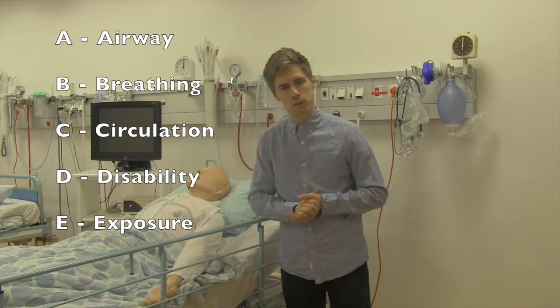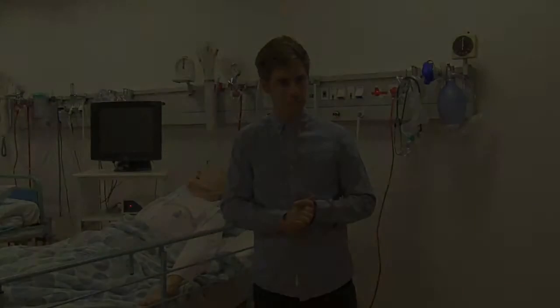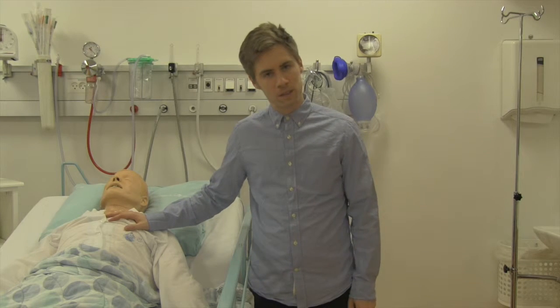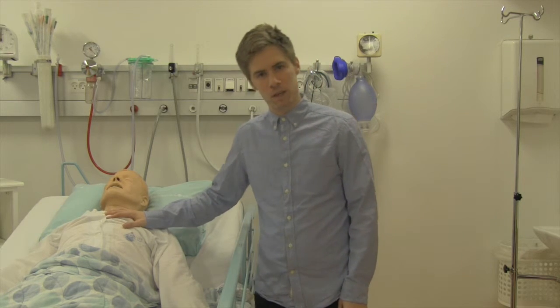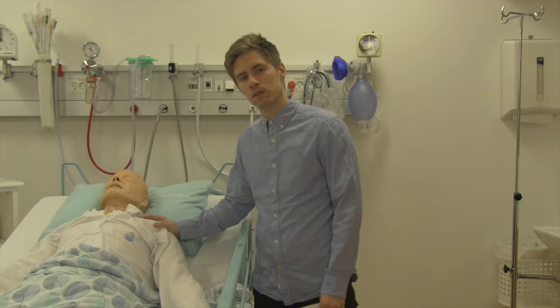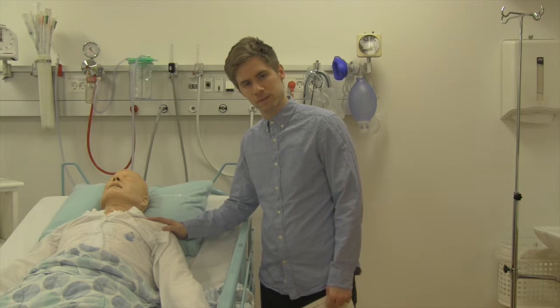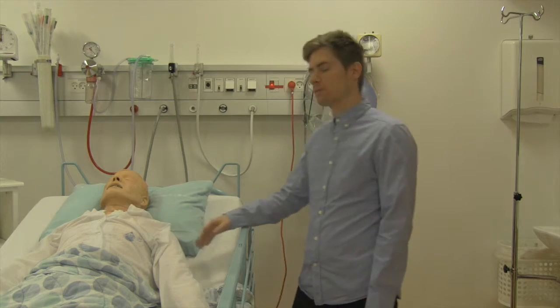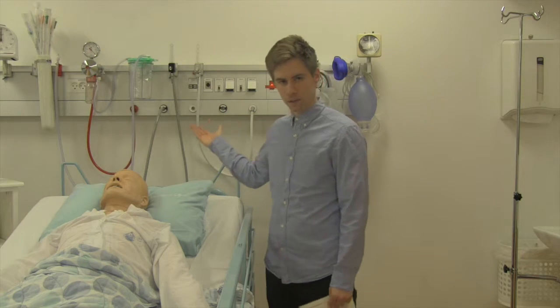Here at CAMES, we use the ABCDE approach. When introducing a mannequin, we start by introducing A, or the airways. We tell the participants that when the mannequin is talking, we know that the airway is patent. We also tell the participants that they can use suction devices and airway devices.